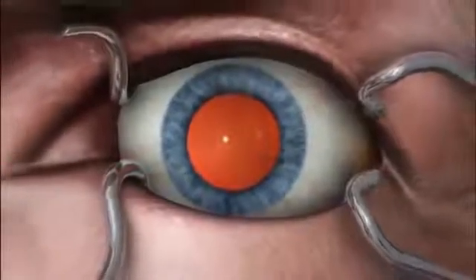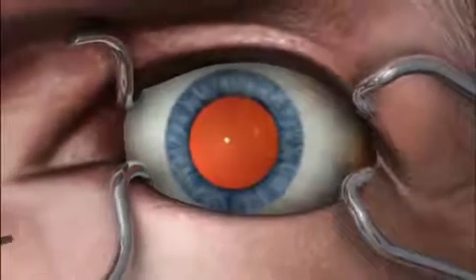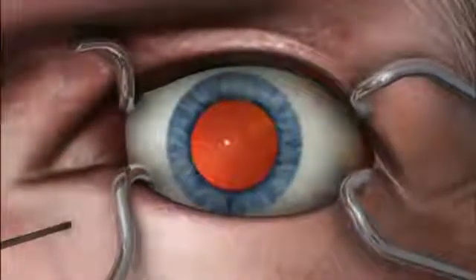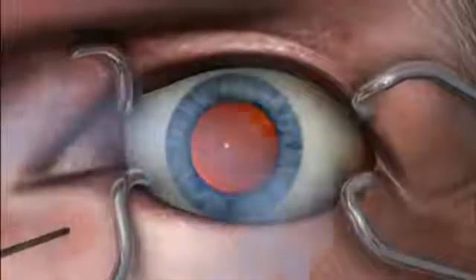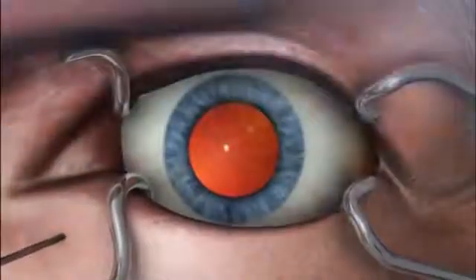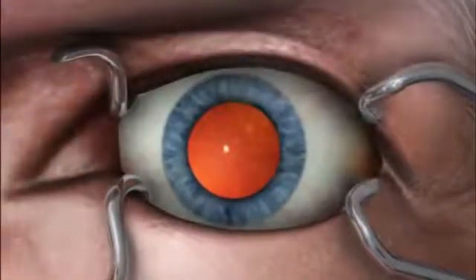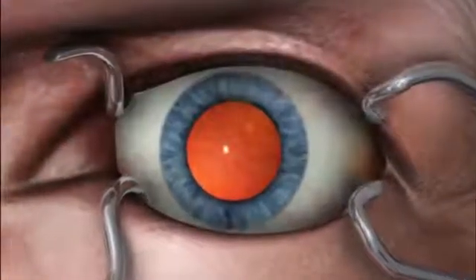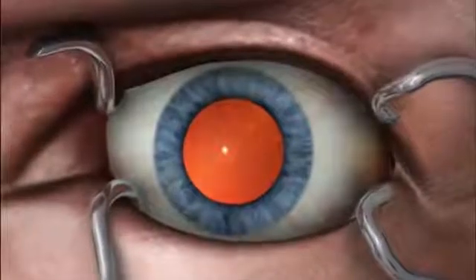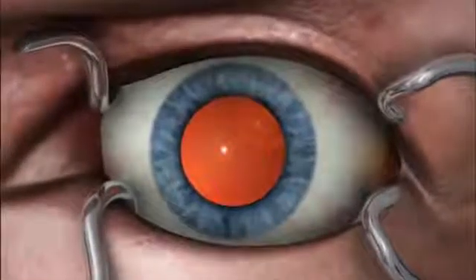Before the procedure, the surgeon numbs the area with anesthesia. Pressure may also be applied to decrease the internal pressure within the eye, which will lower the chances of complications later in the surgery.